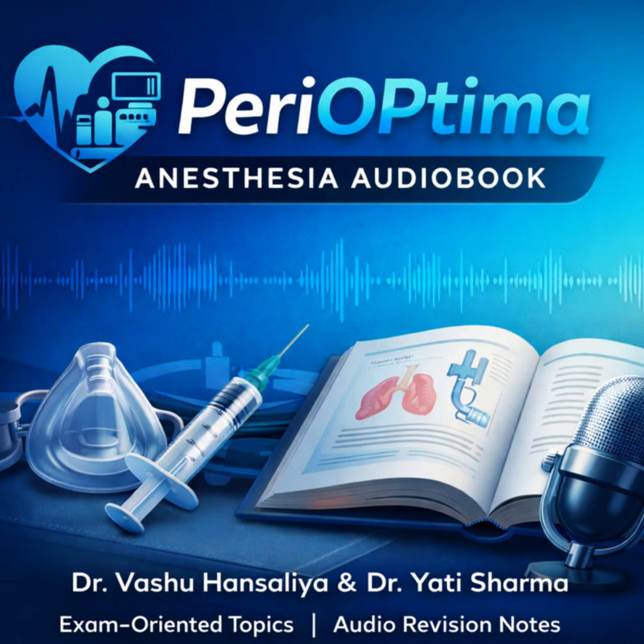Laryngoscopes are crucial for getting a detailed look at the anatomy of the larynx. For diagnostics too. Yes, exactly. Assessing things like vocal cord palsies, identifying lesions for a biopsy, or even helping to guide something like a nasogastric tube when it's being difficult. That's a great point. And you should always remember the basic anatomy for the exam. The larynx's main evolutionary job is protection. It's a valve, a very sophisticated one, to stop us from aspirating. Our tools are designed to temporarily and safely bypass that valve.